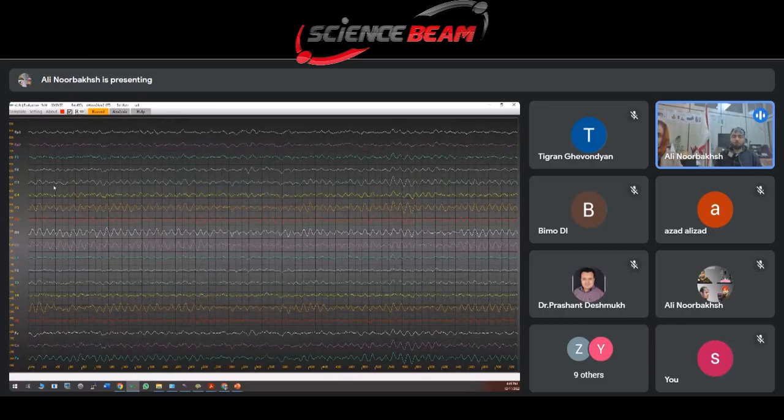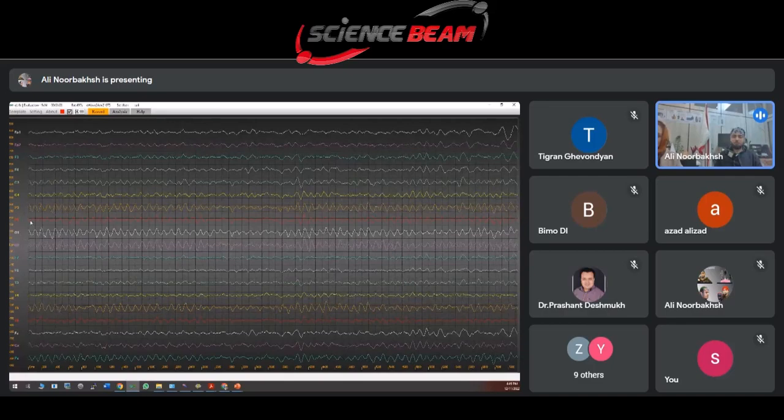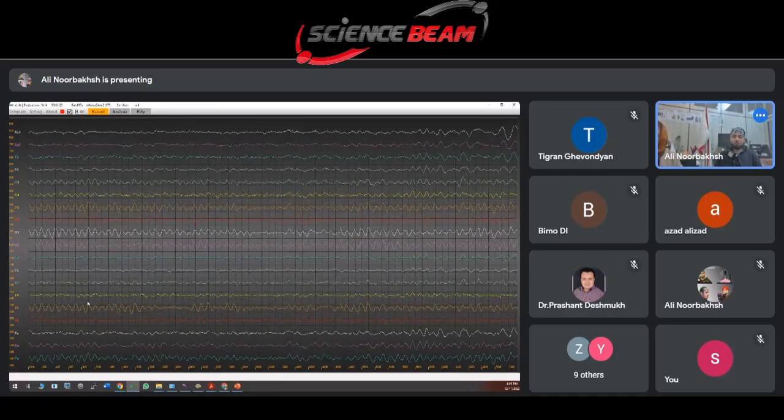This is the alpha wave. On the O1, O2, P3, T5, PZ.